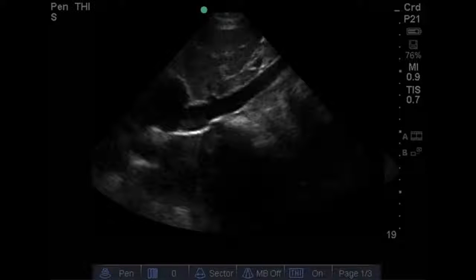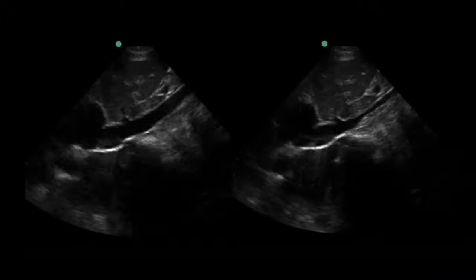So what we're looking for in this view to make sure we are identifying the correct structure is liver on both sides of the IVC, meaning the IVC runs through the liver, not behind it like the aorta. And we're looking for the right atrium, which then lets us identify this tubular anechoic blood vessel as the IVC. And you can see here, well-inflated IVC versus a very flat IVC. And that's where we're looking for the presence or absence of a flat IVC to denote preload, so we can get a sense of preload and volume status should we have a hypotensive, traumatically injured patient.